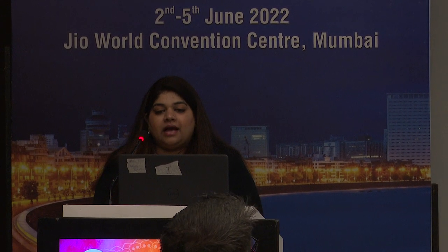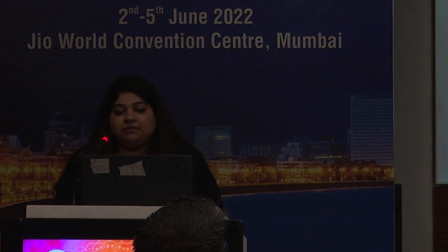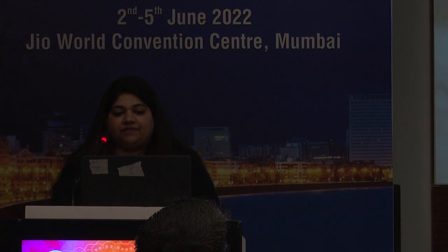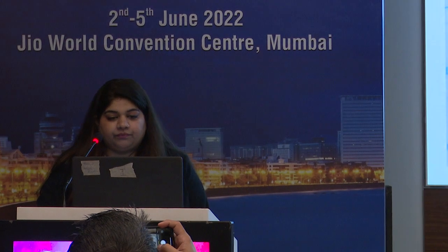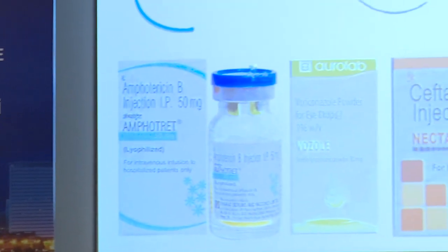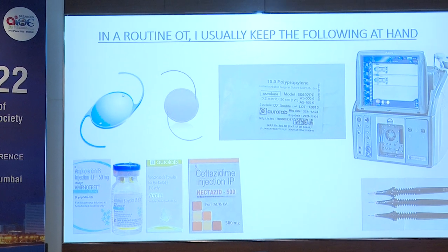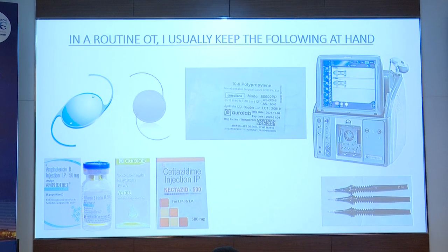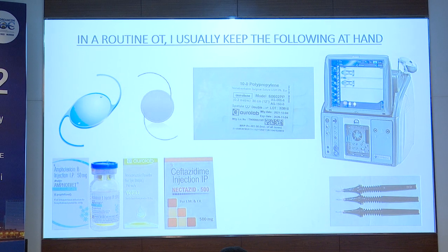Now, a normal penetrating keratoplasty may include just removal of the host cornea button, putting up a new donor tissue and doing the suturing. But sometimes, in spite of adequate preoperative investigations, there are a lot of surprises that may lie beneath the cornea. So in a routine OT, I usually keep the following at hand: a standard power PMMA IOL or a multi-piece IOL, 9-0 or 10-0 Prolene sutures with straight and curved ends, vitrectomy with trocar and cannulas, and intravitreal antibiotics.